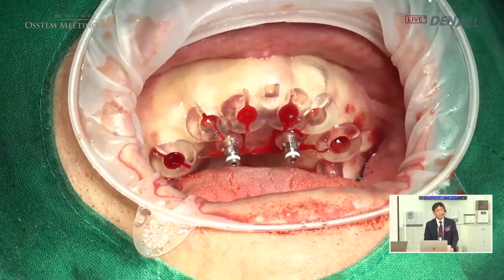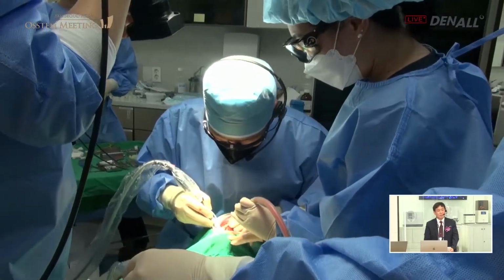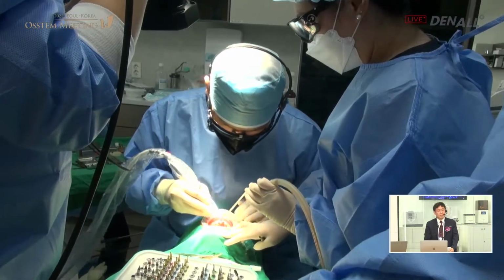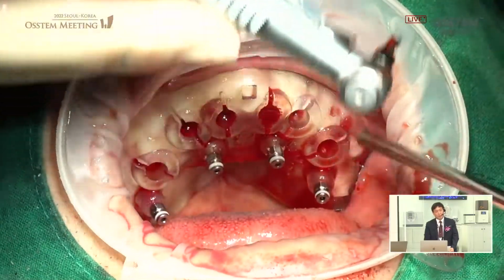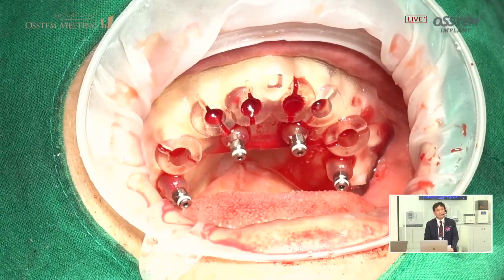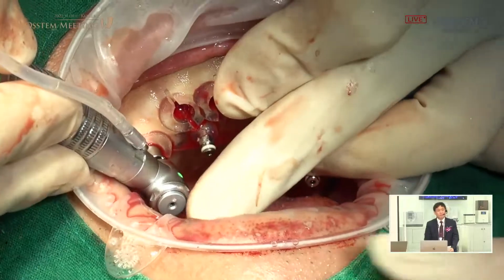So can you change the placement speed? In the posterior area, 4.5 by 10 millimeter was designed. The bone quality is very soft. Placement mode is used to check. I don't think it's going to be easy to do immediate loading here in the posterior area.